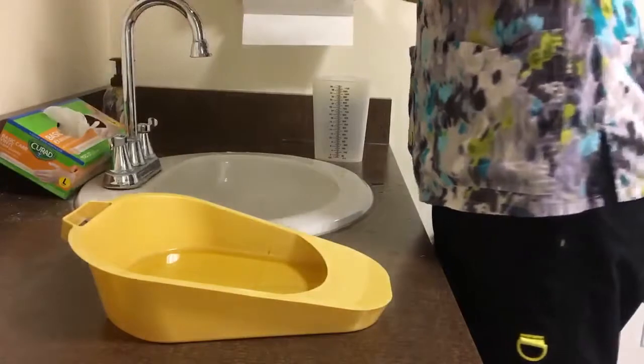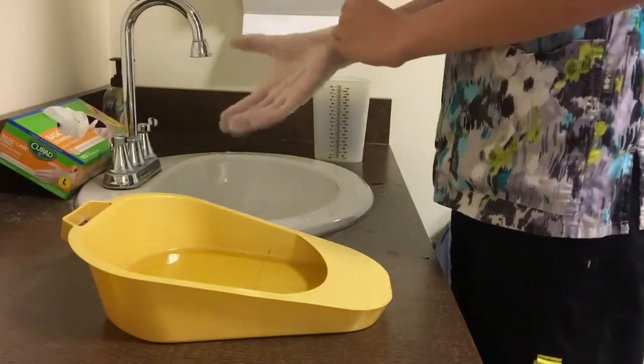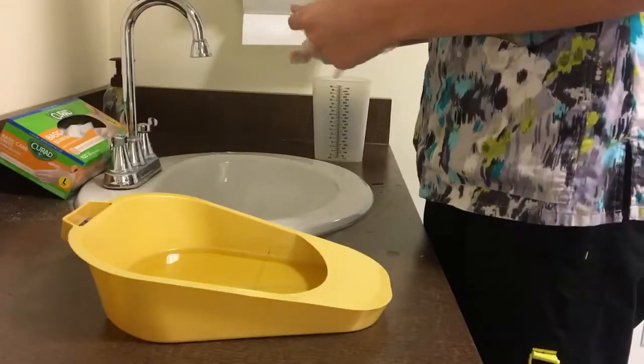Skill number 13: measures and records urinary output. Put on clean gloves before handling the bedpan.